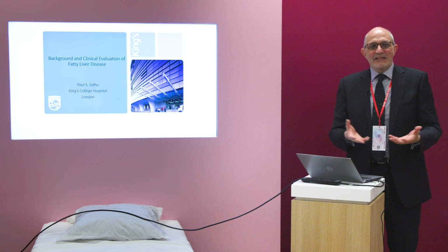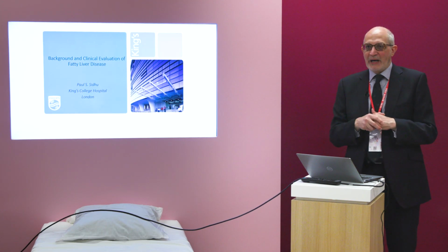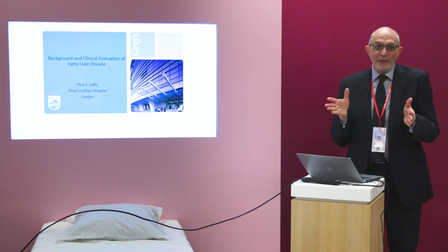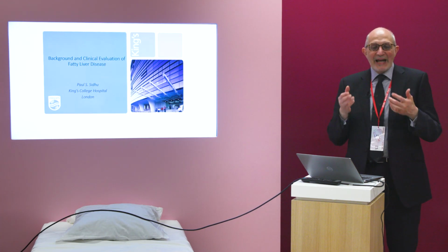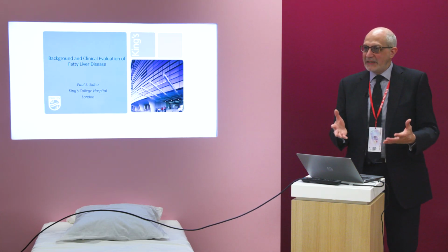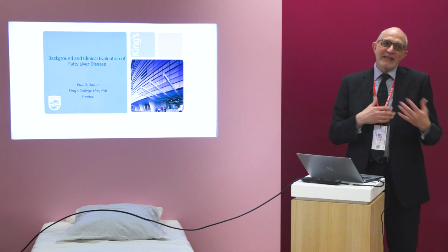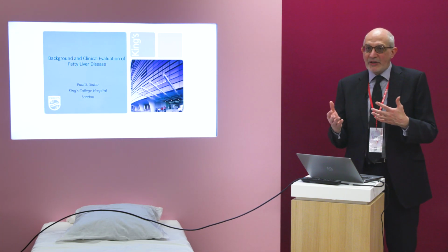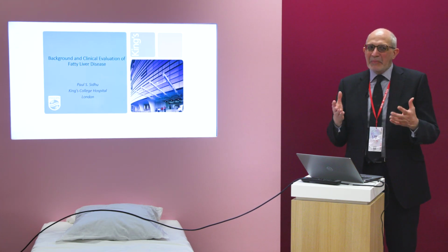And how are you going to survey and look after the 3 billion patients worldwide? You can't do it by MR or CT or anything like that. You've got to do it by ultrasound, and you've got to do it in the primary care scenario, because otherwise you're going to be overwhelmed. I was at a session yesterday where they can do very good MR, very good CT, but it's the accessibility.